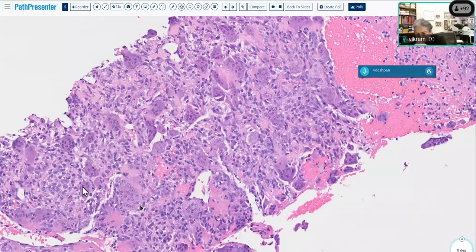Correct. So I think we can do histone stains for GCT because you are seeing predominantly giant cells, but radiologically this is not a giant cell tumor. Exactly. It's one of the mimics of giant cell tumor, but it's not a giant cell tumor. And so we were really worried, could this be a giant cell rich osteosarcoma? And that's the thing that really bothered me. So you're right, G34W was negative.